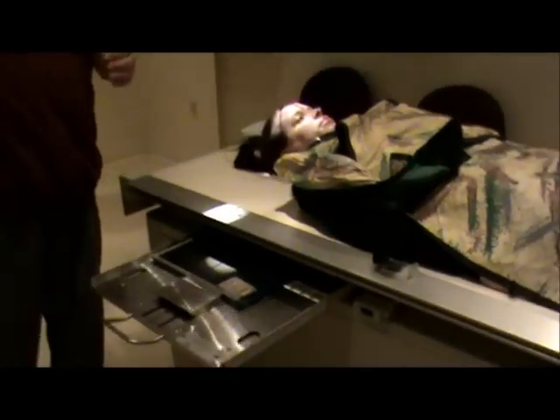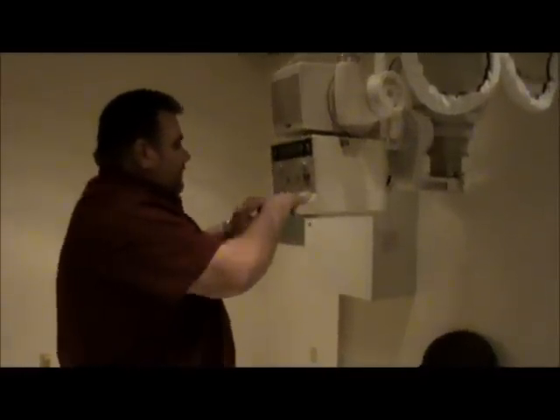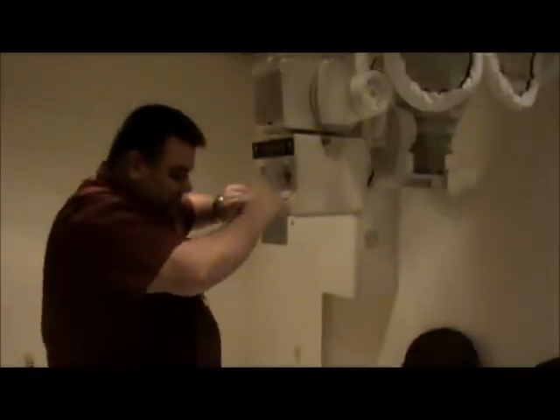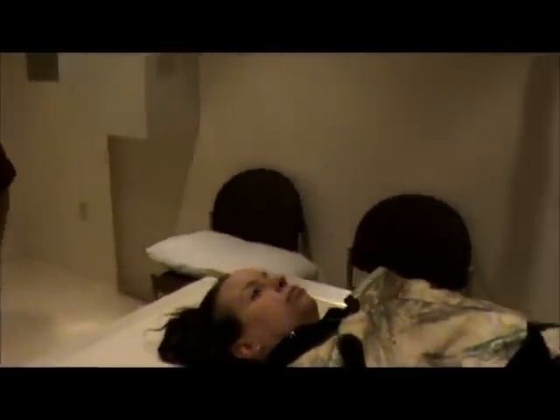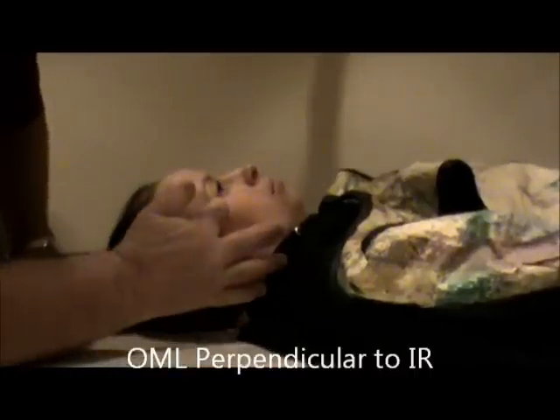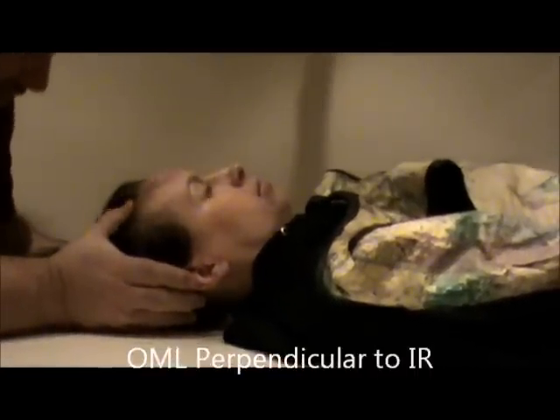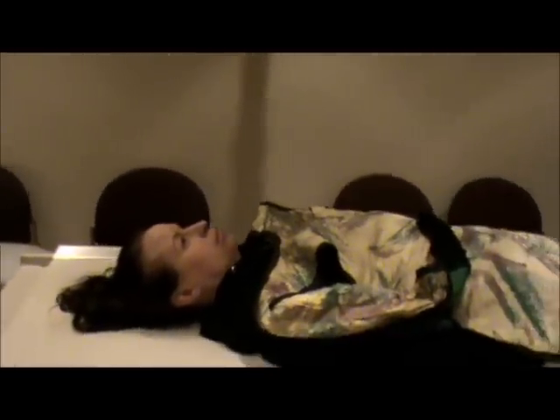The next view we're going to do is the AP. So we're going to take the angle off, recenter, and move the film back to the bucky. Still going to be using my right marker. The position of the patient is still not rotated. The orbitomeatal line is perpendicular — making sure the head's straight and still perpendicular to the IR — and then we can go ahead and start our centering.